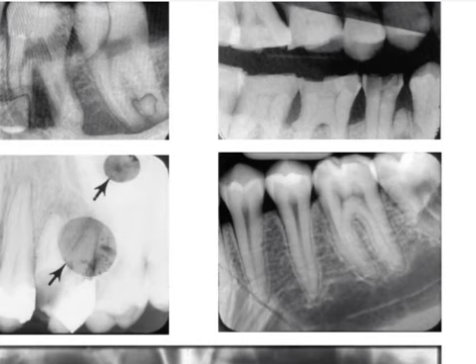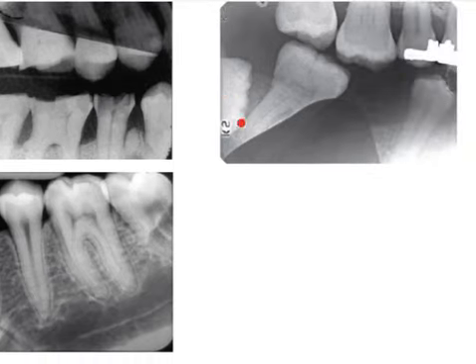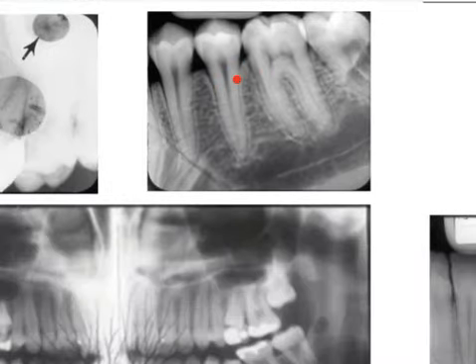Okay, so if there is a film in contact with other film during the time you are processing, then it leads to an image like this. Okay, one film contacting the other, you can see the edge of one of the films. Okay, this is because of black paper and this is because of films contacting each other.